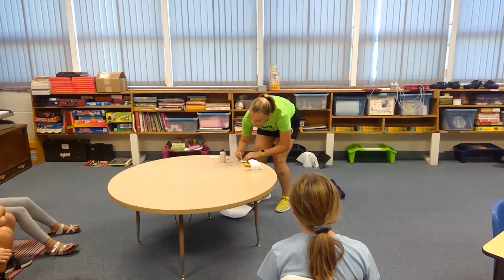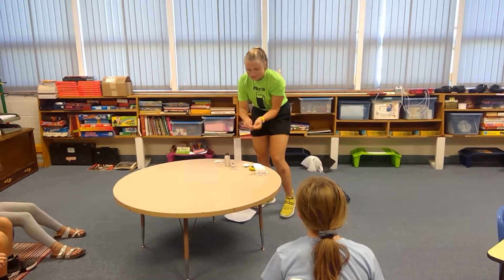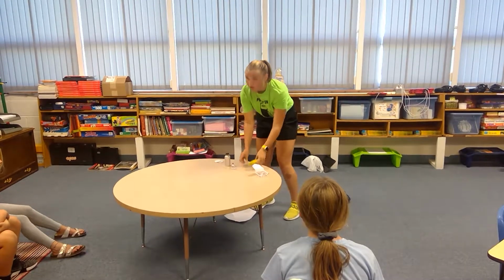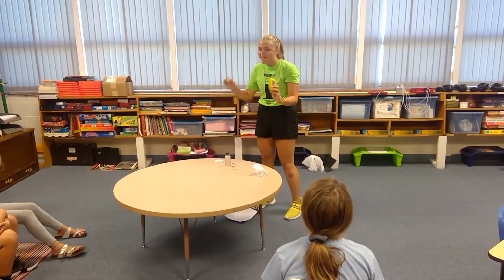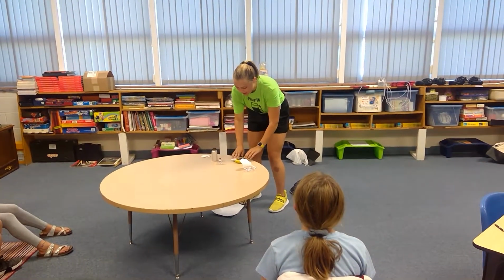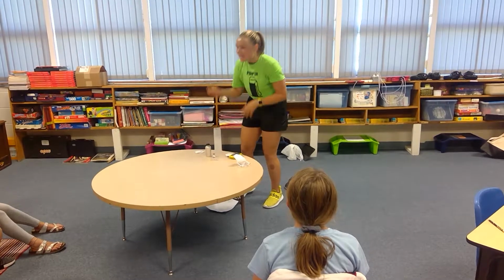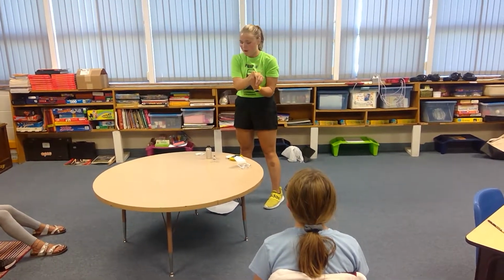You hear that beep? That means the pod and the PDM are listening to each other now. So the PDM and this work on Bluetooth. So the coolest thing about them is you don't need a tube in between the two. Now the next step is called priming, which is where the insulin I just put in a little spot in here is going to be moved up into the tube of the pump.